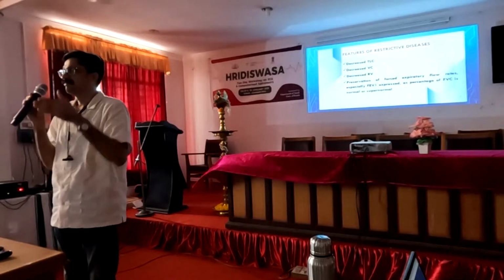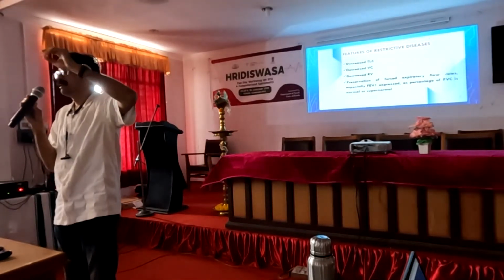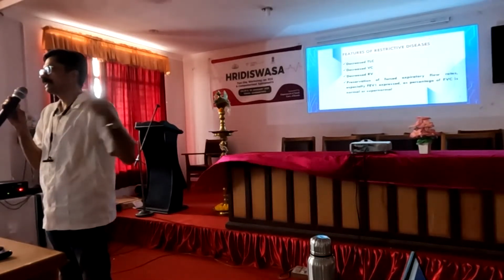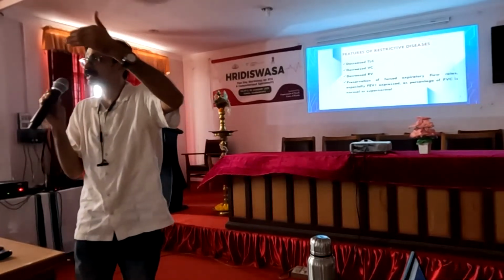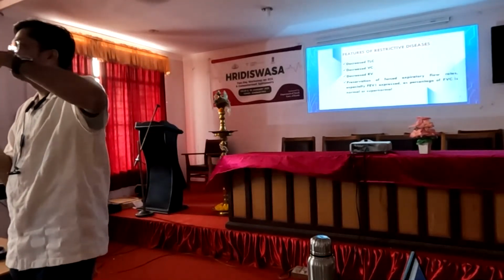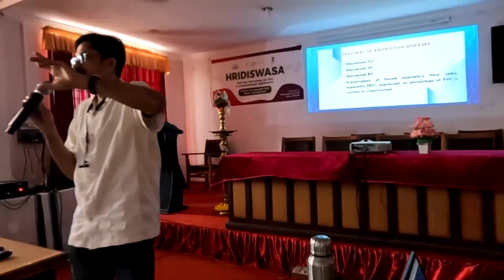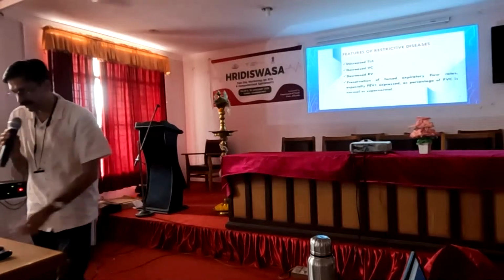In obstruction, 4 liter is the forced vital capacity, but the FEV1 is very low. But here, 4 liter is the forced vital capacity, and the forced expiratory volume will be relative, that is 3600. Clear? But I will show.